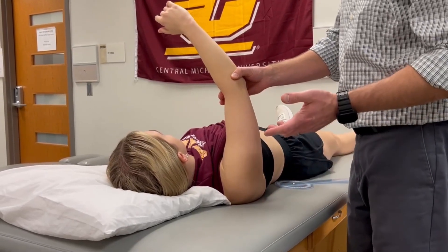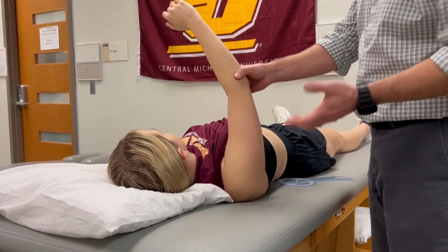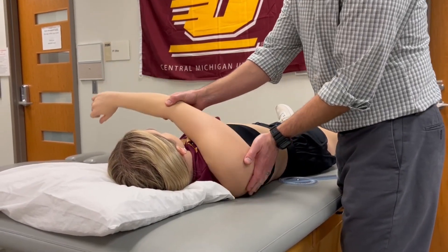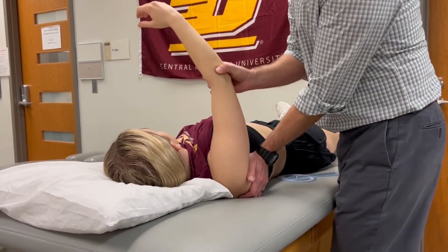As with all of these passive shoulder range of motion measurements, you need to make sure that you're firmly stabilizing the lateral border of the scapula. If you don't stabilize the scapula, you can get all sorts of excessive scapulothoracic motion. So you need to stabilize the lateral border.